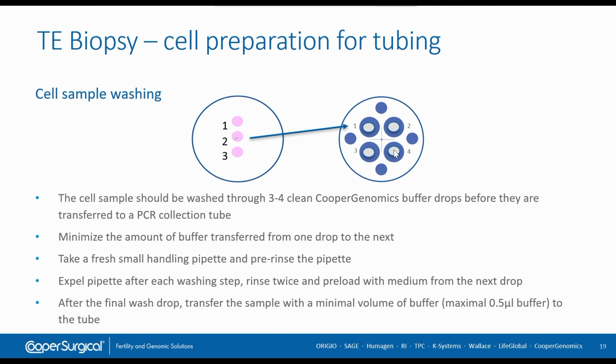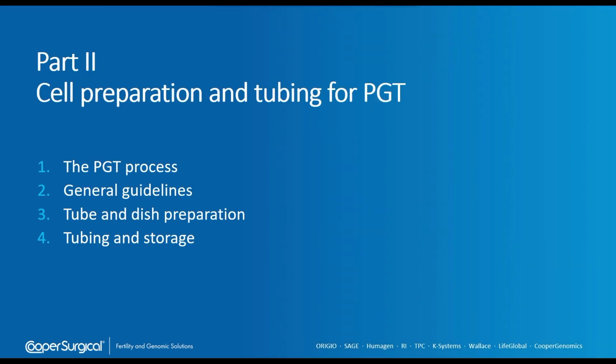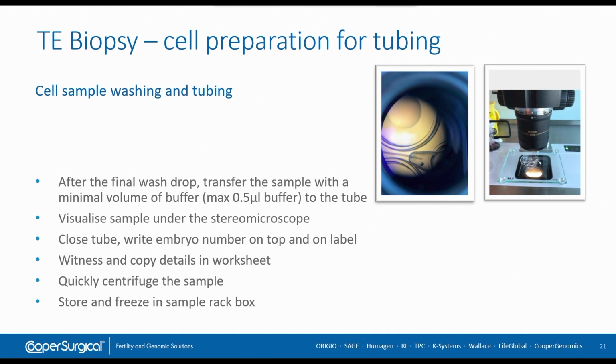After this final wash drop in 4, we will take the sample and bring it into the tube. The volume of buffer with the sample going into the tube is not more than 0.5 microliter of the buffer. So how do we do that?